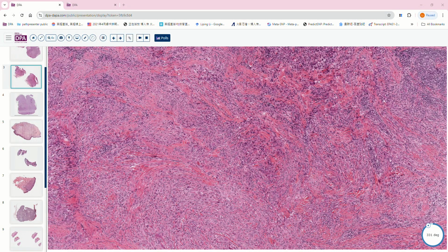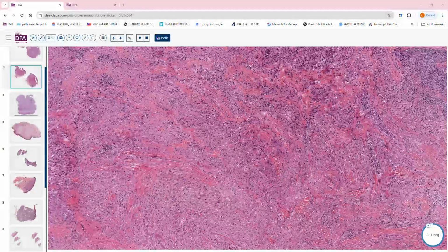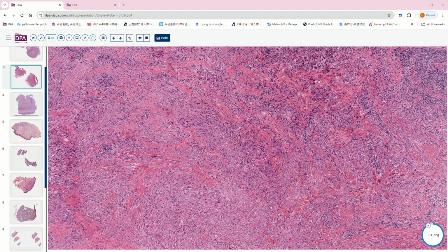Yeah, so the summary of these three, we always put them in the differential at low power. I just highlight for this reticulohistiocytoma, we have glassy, eosinophilic cytoplasm. We call this two-tone giant cell, but we see fewer giant cells, and fewer lipid-filled histiocytes. And then for the JXG, we have more foamy histiocyte and more giant cells. And for the Rosai-Dorfman, we can see a little bit of lipid-filled histiocyte, but we have plasma cell and we also have emperipolesis.